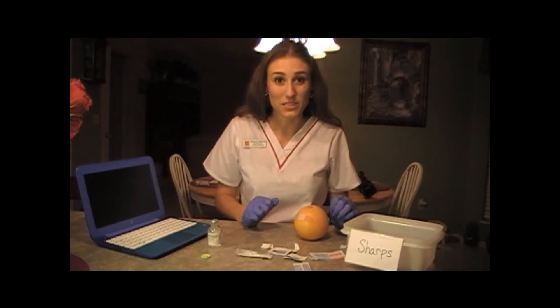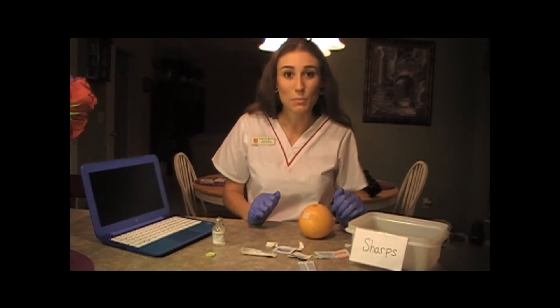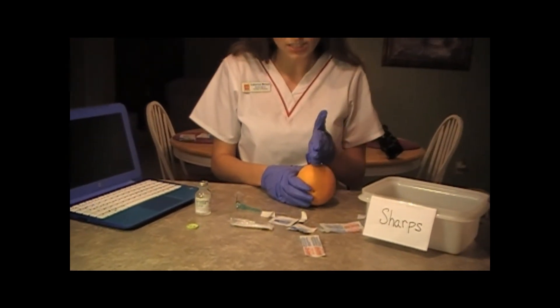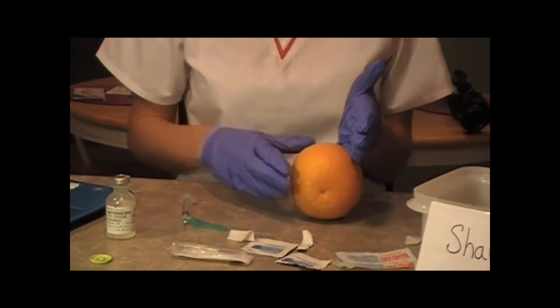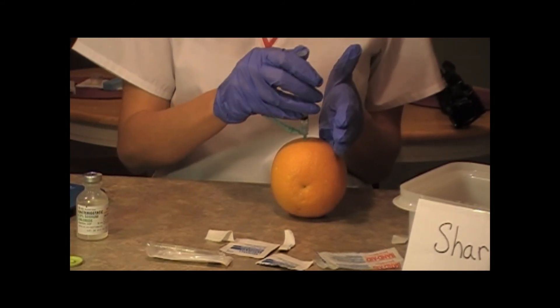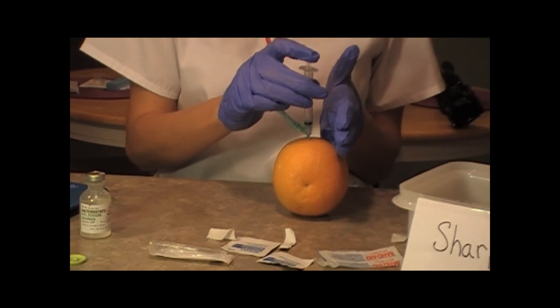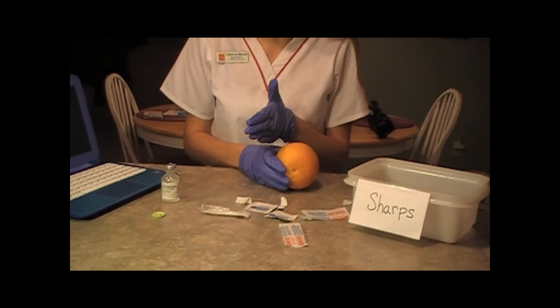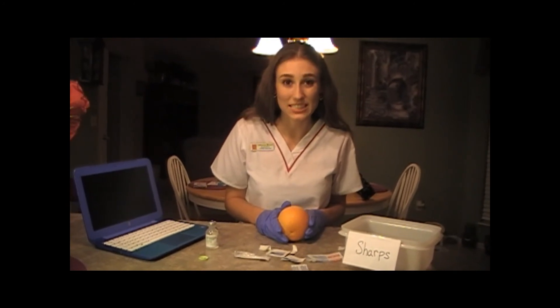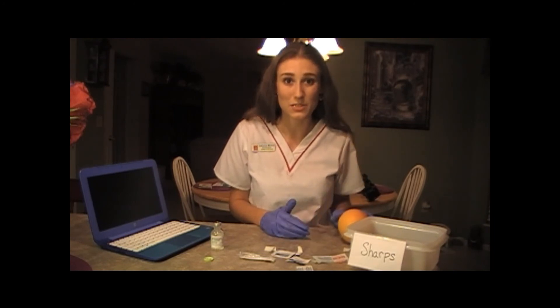Now if you're giving an injection in any other muscle other than the deltoid — like the hip or the leg, the ventrogluteal or vastus lateralis muscle — you want to make sure you use the Z-Track method. To demonstrate: you're going to take the skin and pull it laterally to the side tight, take your needle, inject again at a 90 degree angle, aspirate back to make sure there's no blood, inject your medication, hold it there for about 10 seconds, pull your needle straight out, put it in your sharps container, and then let the skin go. This locks your medication in place and decreases irritation. When you give a flu shot or any injection in the deltoid, you don't have to do that because the muscle is not very well developed.